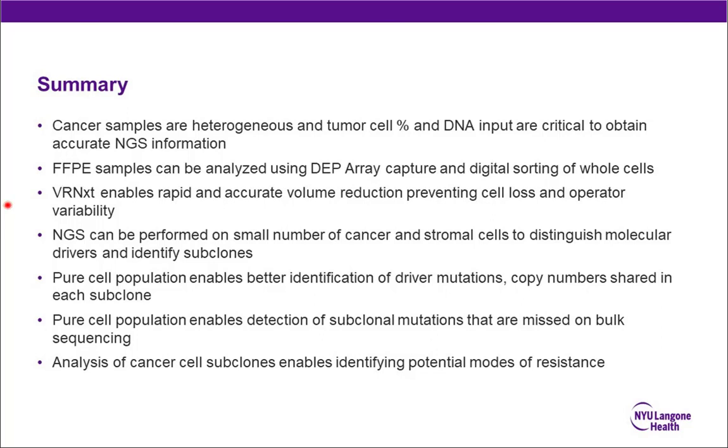The advantage is that these samples will just be added to our regular workflow, so you don't have to run DEPArray isolated cells separately from the regular bulk sequencing, which is still the majority of our samples. We cannot do this on every sample in a clinical workflow, obviously, but we just add it on. So to answer the question, about 3-4 days of extra work before you can load it and start preparing for NGS is a reasonable assessment.